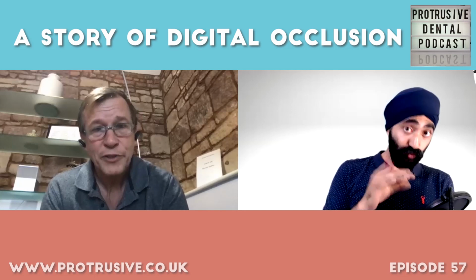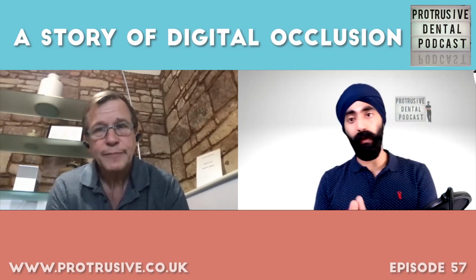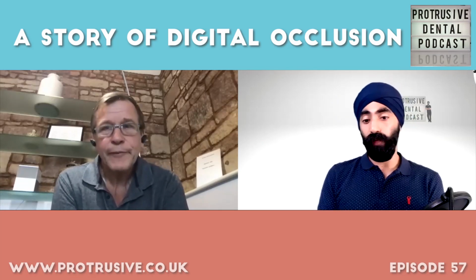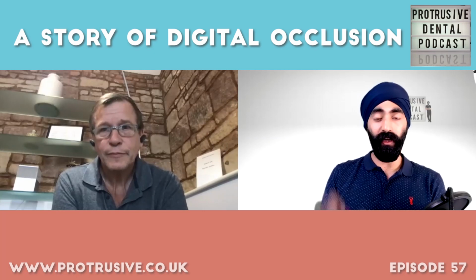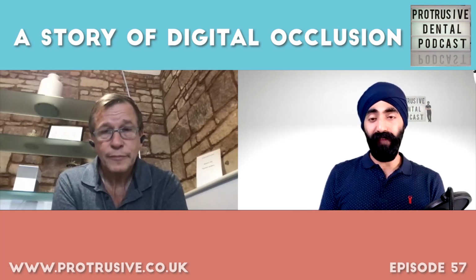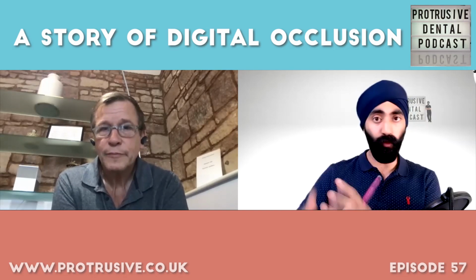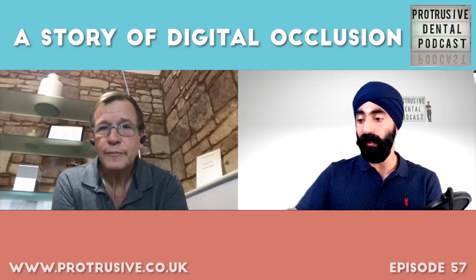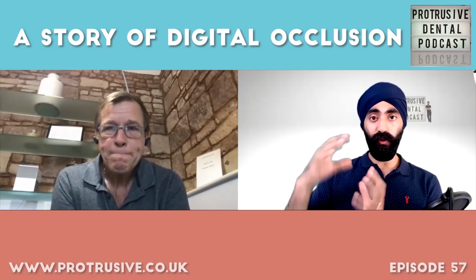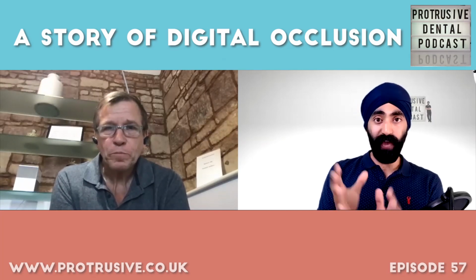So just to roll it back, the reason Ian mentioned this, guys, I emailed Ian a little bit about what we're going to talk about. One thing I told him was my experience of digital so far is when I've recorded the vertical dimension near about where I want the patient to end up before I restore them. Typically it's composite with my level of experience at the moment, moving more to ceramic, but at my level, quite junior, doing a lot of composite work, and transferring the digital wax up into the mouth, and then getting the patient to close together.